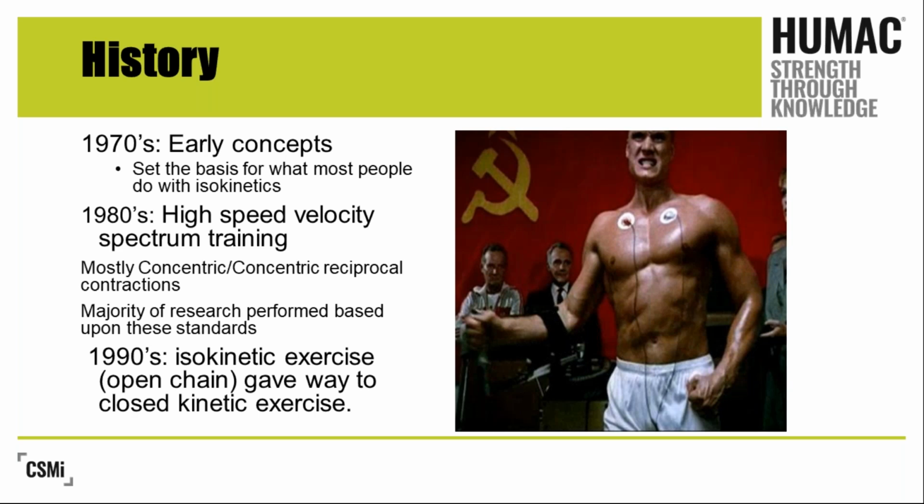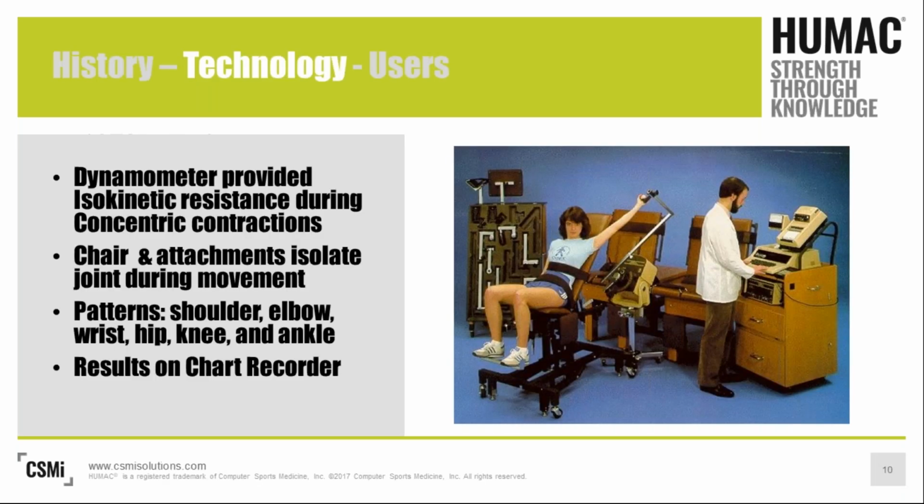And there's some interesting reasons behind that that we're going to explore in some of these future webinars. But here's an interesting aspect. One of the questions I used to hear all the time is that isokinetic exercise wasn't functional. Now, if we're really doing a lot of concentric reciprocal contractions, I'd probably tell you that that's probably true.